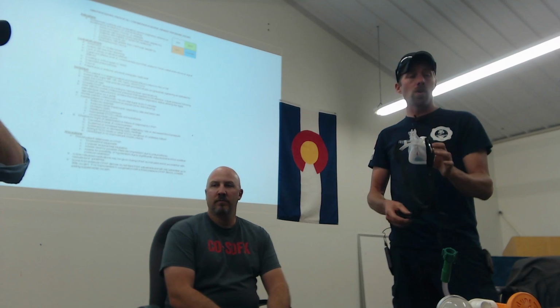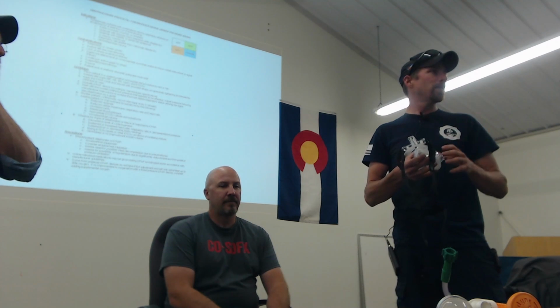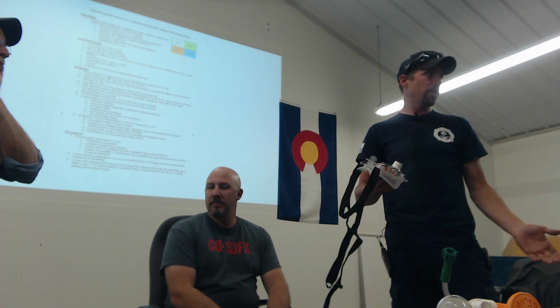You're going to want to start coaching them, telling them, okay, we're going to change you. We're going to put you on a different mask, but this one's going to be a little different because it's going to be strapped to your head. It might feel claustrophobic, but I guarantee you that it is supplying way more air, 140 liters a minute, way more air than anybody can ever breathe.